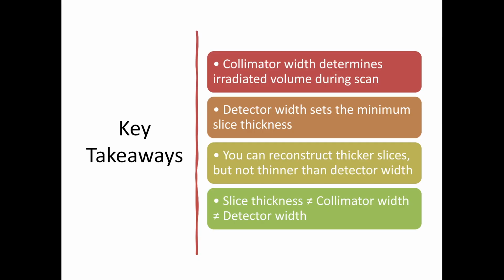Understanding these differences is key for optimizing image quality and managing radiation dose.